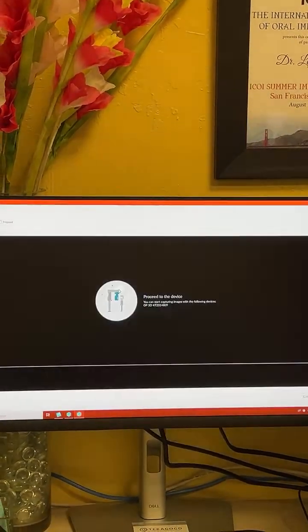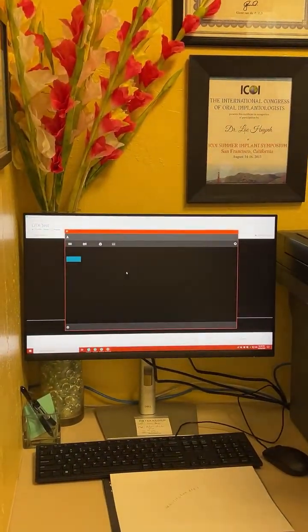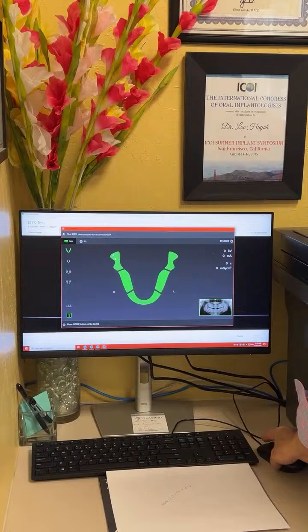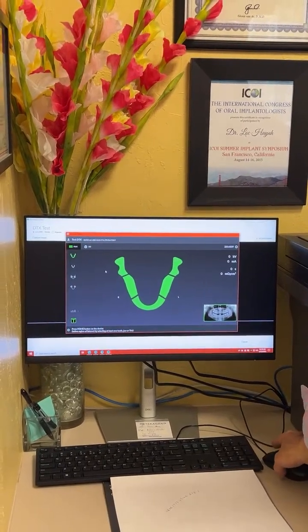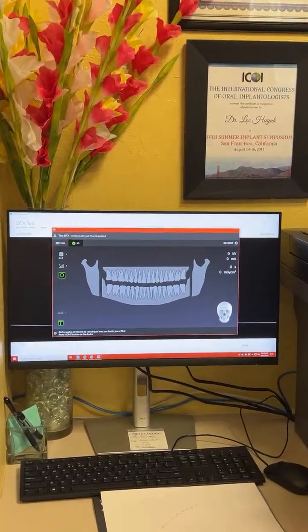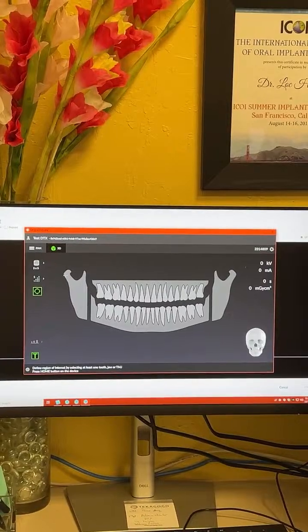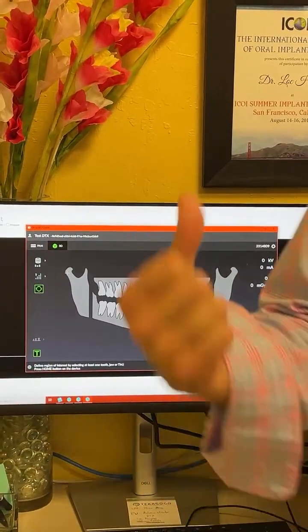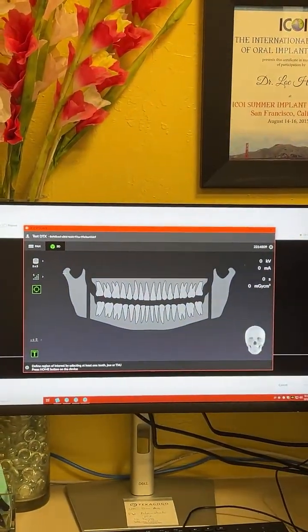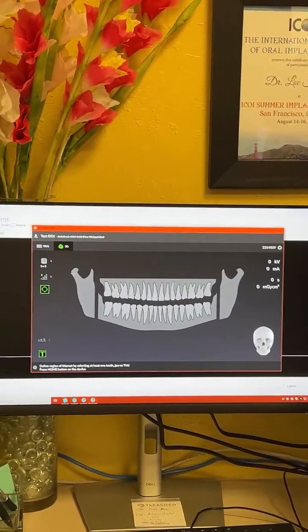So you mentioned that you want to turn that on first, right? The machine. Yeah. Okay, so it's on. That's 2D, and now switch to 3D. Got it. But we can use the app to tag for the pano too, right? If we select, you could take a pano, but then it's going to go directly into DTX. It won't go back into EagleSoft. You'll have to export it later. Got it. DTX. Okay.